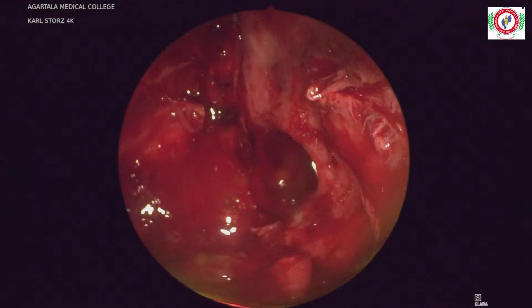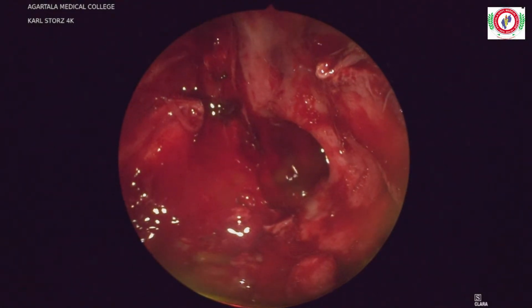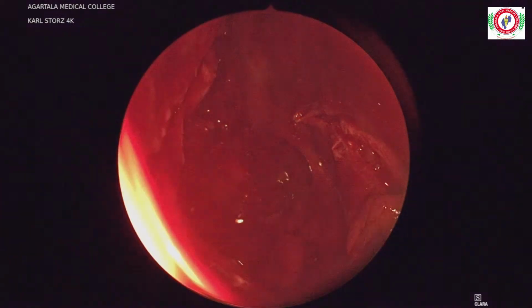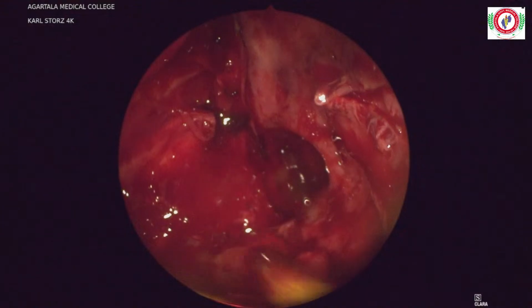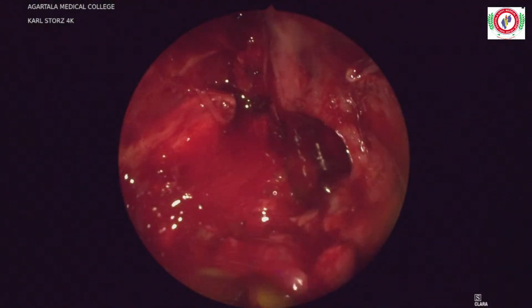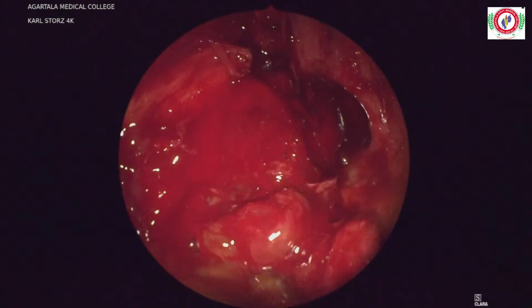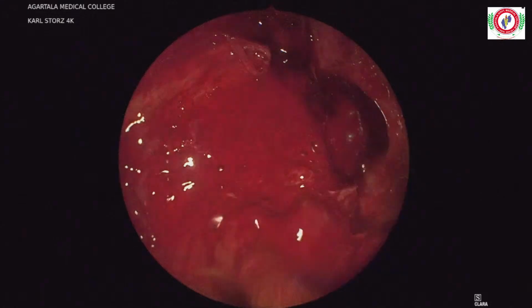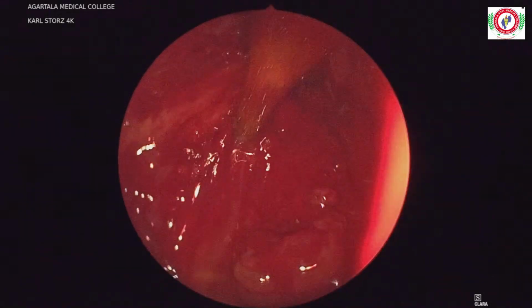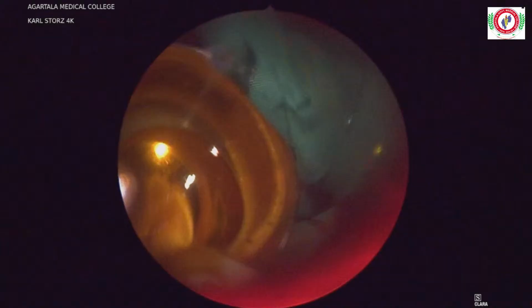Give curved suction. Curved suction. So that is the last part of the tumor that is left there.